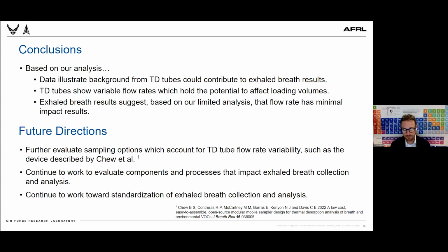We are always looking for ways to improve our sampling, and Christina Davis's group came up with a sampling device that does real-time flow rate. That is a viable option, and we're investigating something similar. We want to continue working on standardization and evaluating things that impact exhaled breath collection and analysis.